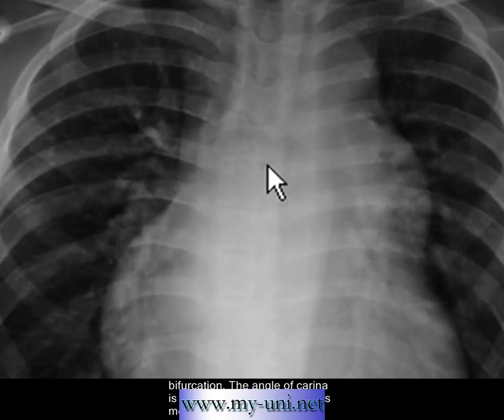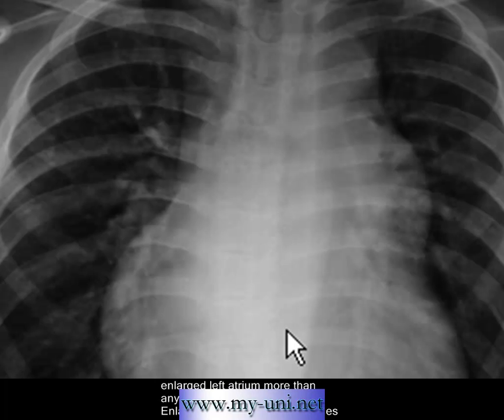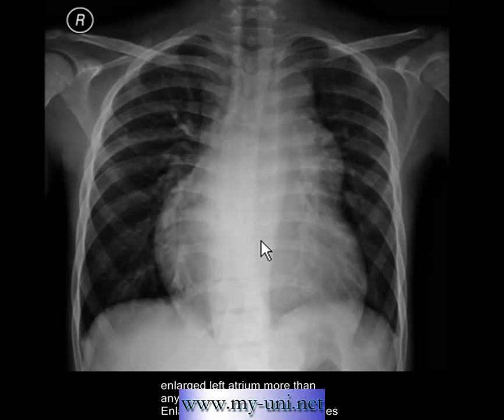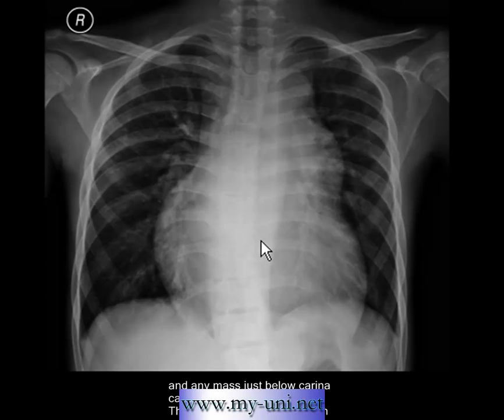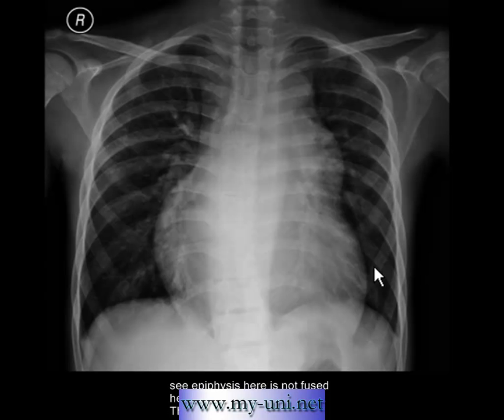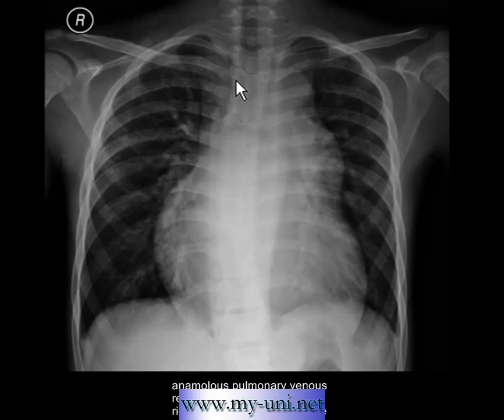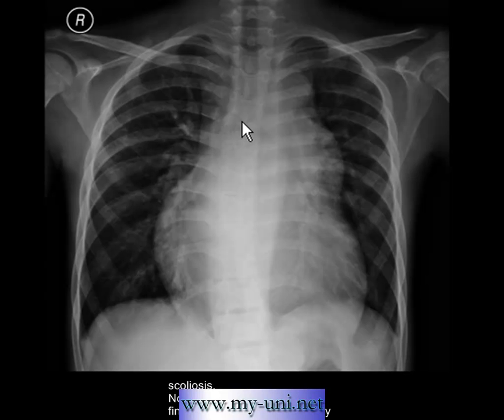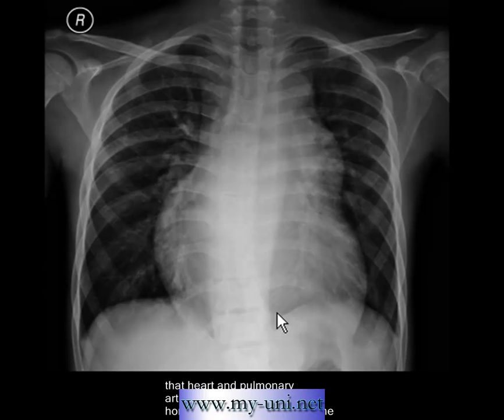The angle of the carina is clearly more than 70 degrees, most probably indicating an enlarged left atrium. Enlarged sub-carinal lymph nodes or any mass just below the carina can also increase this angle. The X-ray is of a child, as you can see from the unfused epiphyses. The thoracic spine is slightly bent towards the right side — this is scoliosis, not a positional artifact.